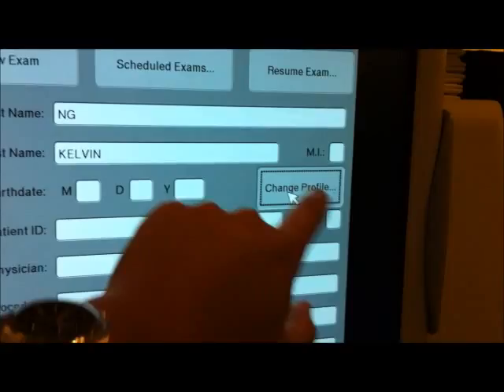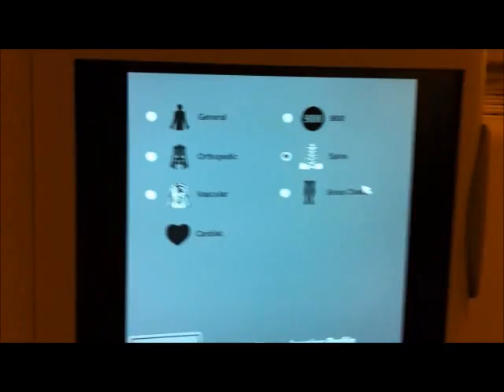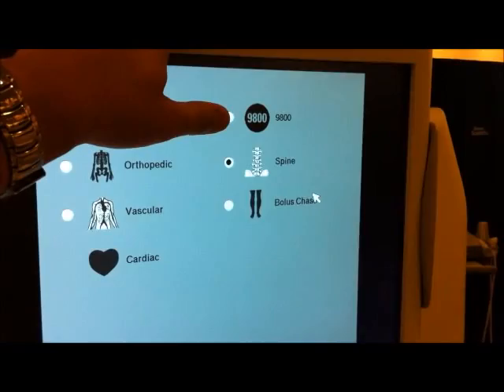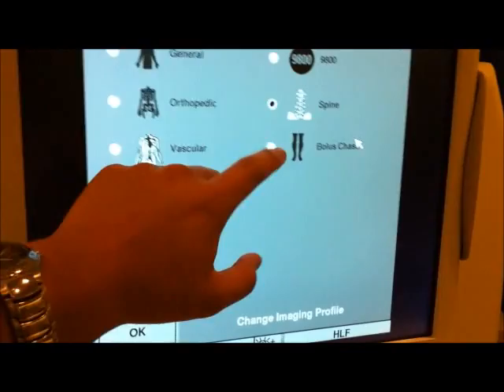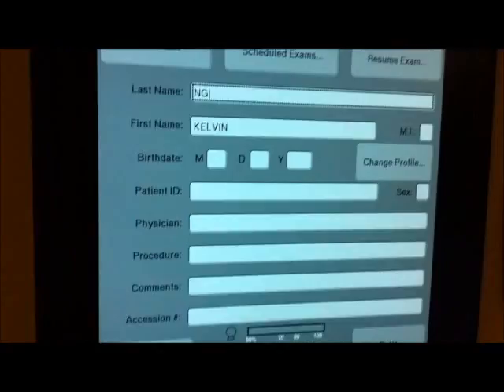Let's change the profile here. With the 9900, you have to pick a profile: whether it be General, which is just general fluoroscopy; you can copy and emulate the 9800 OEC C-Arm; spinal work; orthopedic work; vascular; and a bolus chase for basically an angio. Let's just use General.